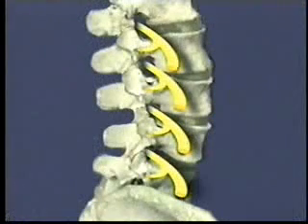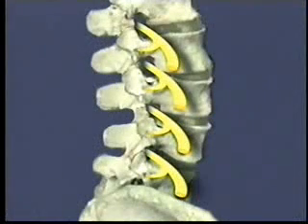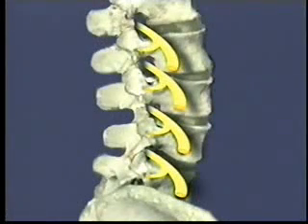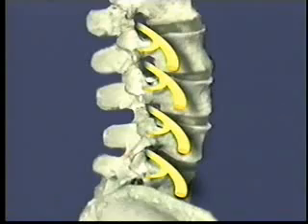The nerve roots emerge laterally through the intervertebral foramina. Since the needle will be placed caudal to the termination of the spinal cord, there is little danger of paralysis with the lumbar puncture.